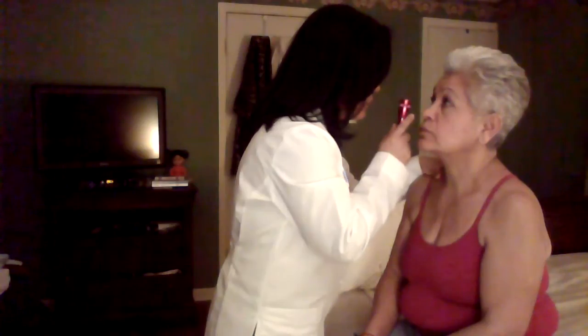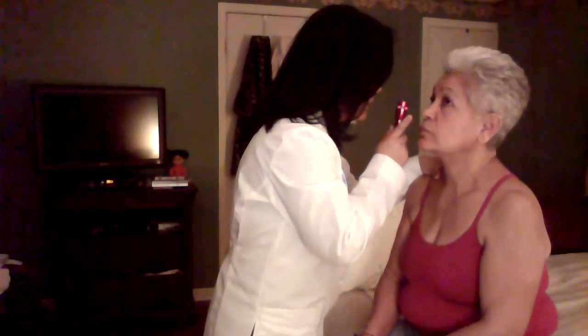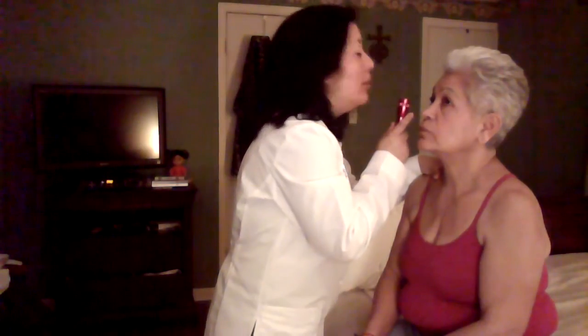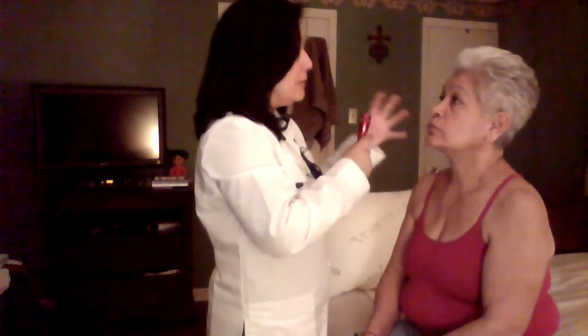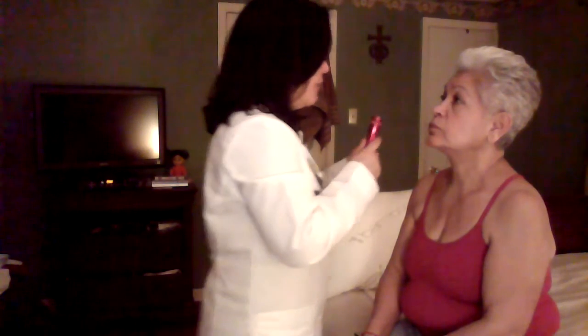And as I bring it close to you, one of the things I'm going to be looking for is the red reflex, the retina vessels, the optic disc, and macula. I'm also looking for any papilledema, any hemorrhage, or any type of exudates. I'm going to repeat the activity once again, and look for the same landmarks on the left eye.